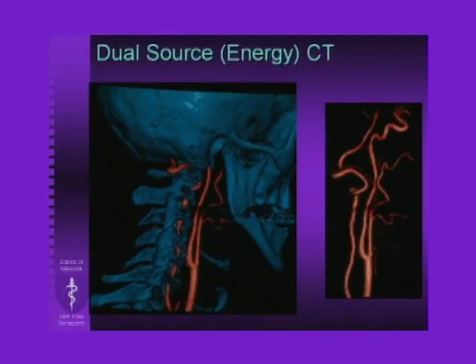The more interesting way might be, and this is early to tell, using dual energy. So Siemens just announced, and they have some pictures out front, a scanner with two heads or two tubes and two detectors. And in theory, what you could do with that is run 2 kVs through it and thereby get images that are different between the bone and the vessels and do an automatic subtraction in real time without having to actually remap the images to one another. And that would be very cool if that happens. It's a little bit early to tell, but that's kind of where some of this is heading.